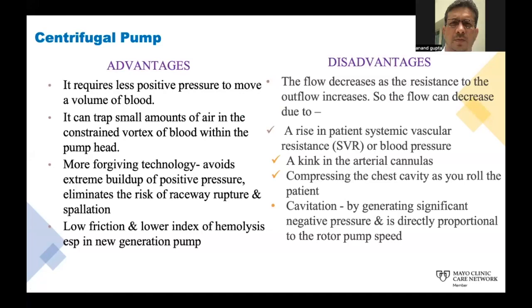But what are the disadvantages? The flow decreases as the resistance to the outflow increases. So the flow can be decreased due to a rise in SVR or BP, a kink in the arterial cannula, and compression of the chest cavity as you roll the patient. Cavitation is one of the important disadvantages in this pump, generating significant negative pressure, and is directly proportional to the pump speed.